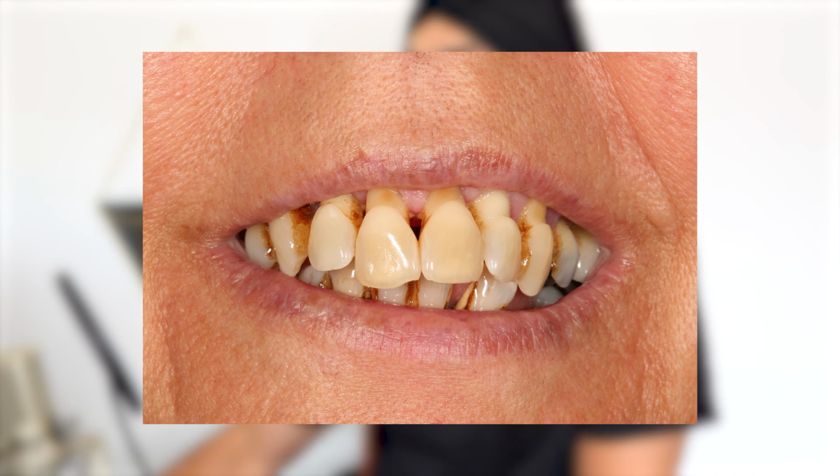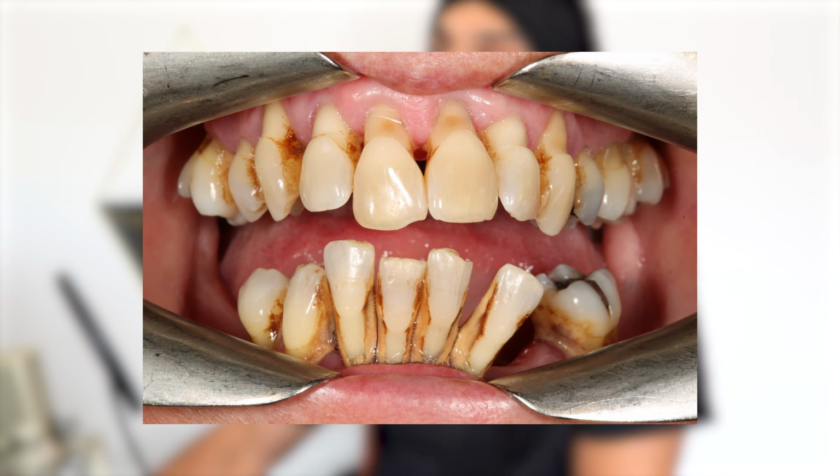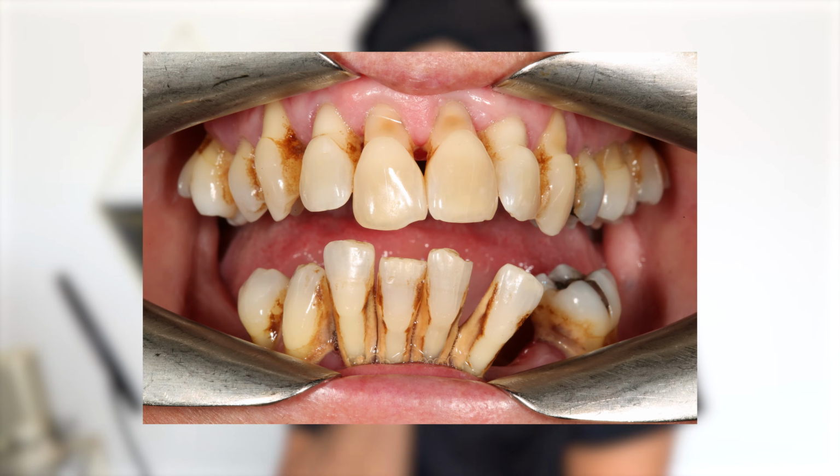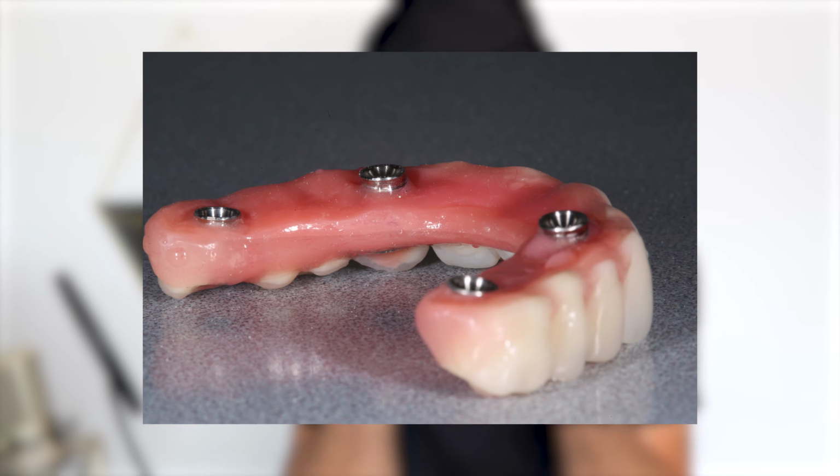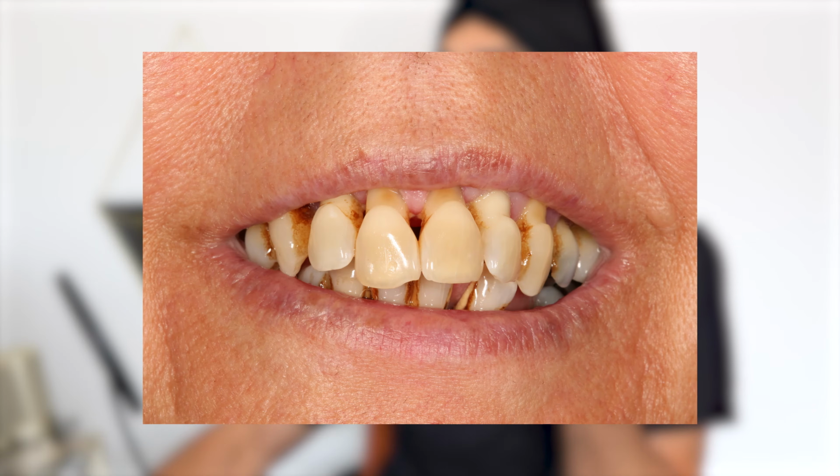If we jump to a photo of the lower teeth, you can immediately see why this lady needed to have all-on-4 treatment. A lot of these bottom teeth are all completely loose, and it makes it tricky to take an impression or a scan. If you imagine we take a mold, the teeth are going to move a little bit, and we need to make a denture out of this. We need to make a temporary denture, which we're going to convert into our temporary bridge. That's our goal.